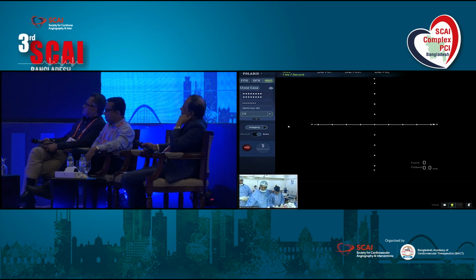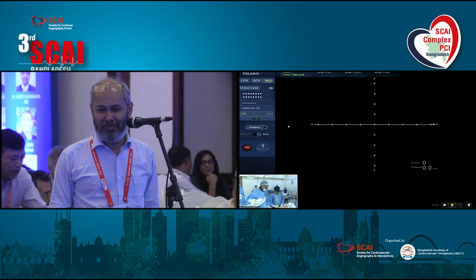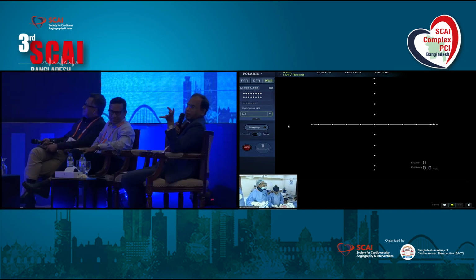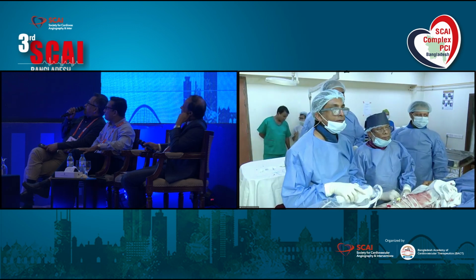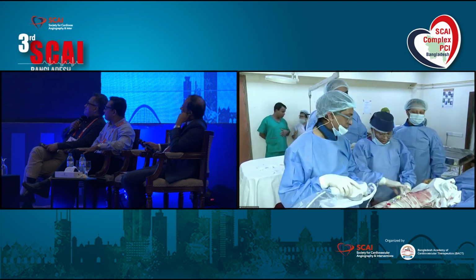Then Professor M.J. Azam will allot another 2 minutes. Yes, sure, because this is learning for the juniors. The question is whether IVUS can change your strategy in relation to the angiographic findings. But it isn't required for IVUS in the distal segments, particularly with your experienced team.